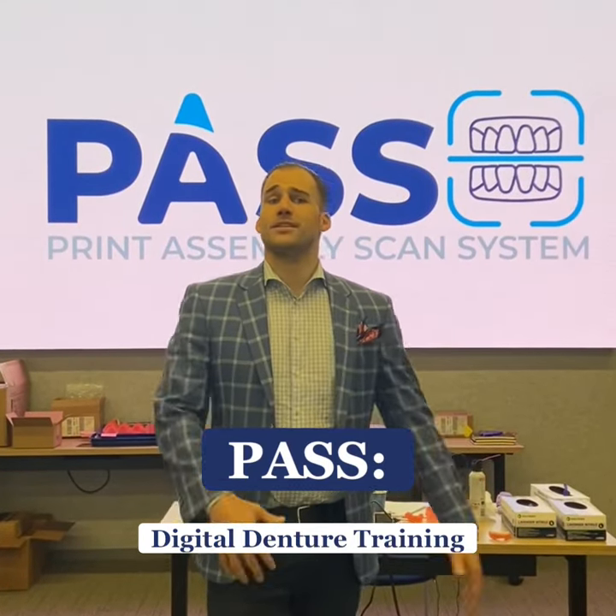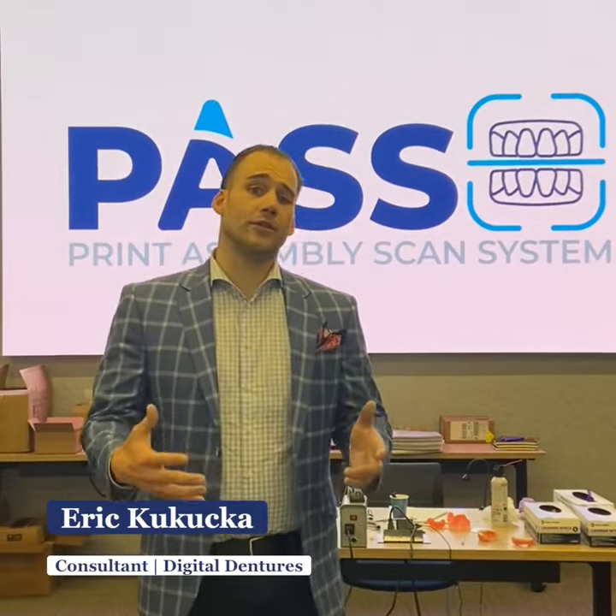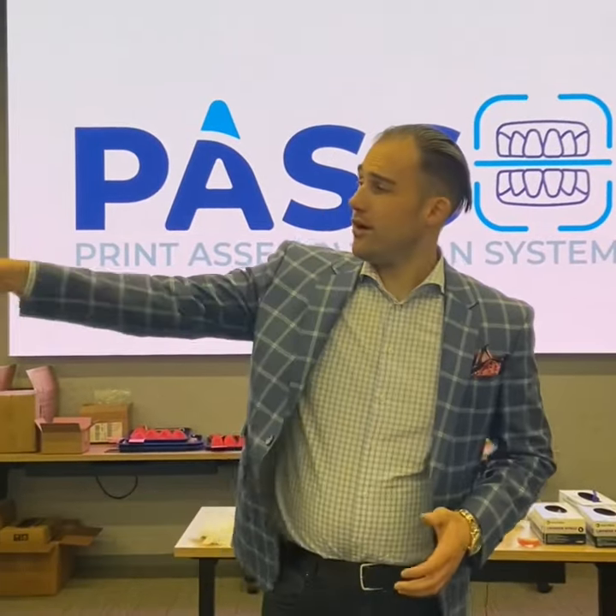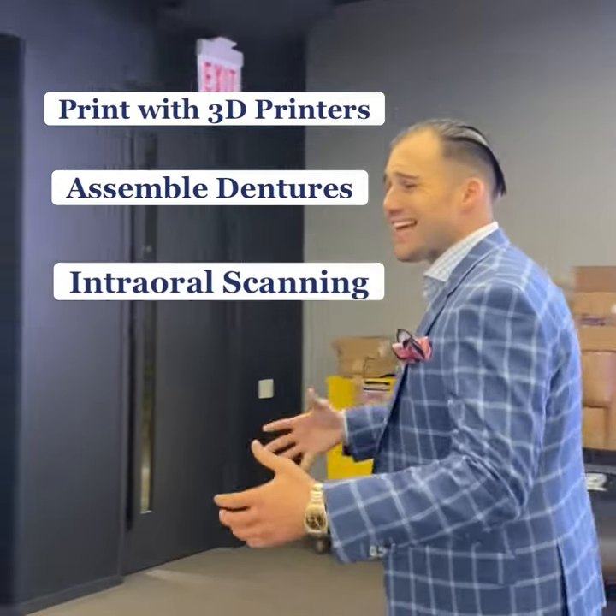Welcome to PASS, Print Assembly Scan System. What are we doing here at PASS? We're teaching our dental technicians how to print on the 3D printers, how to assemble dentures, and then the scan system, which is in the next room, using intraoral scanning.